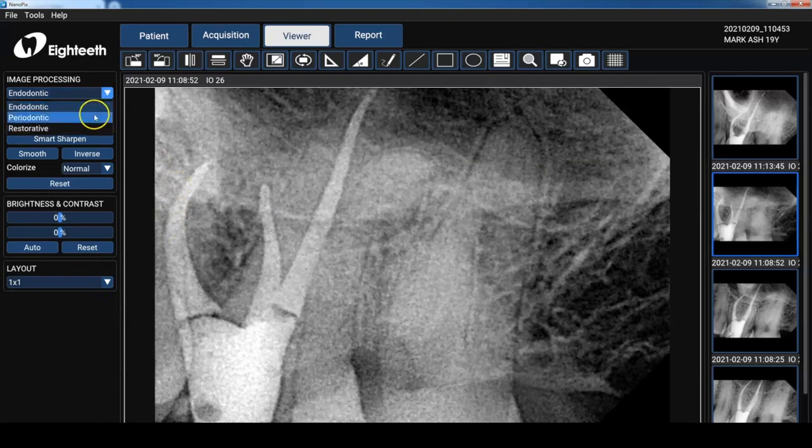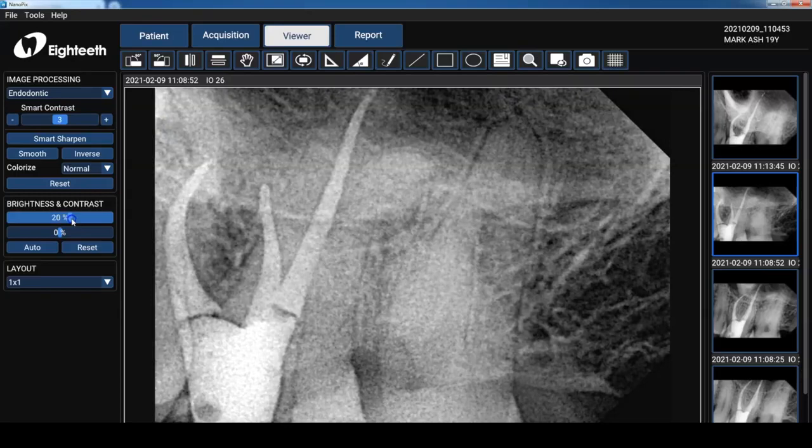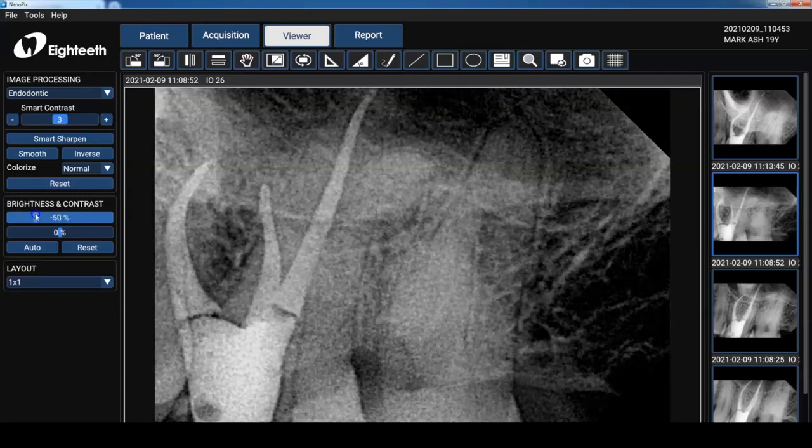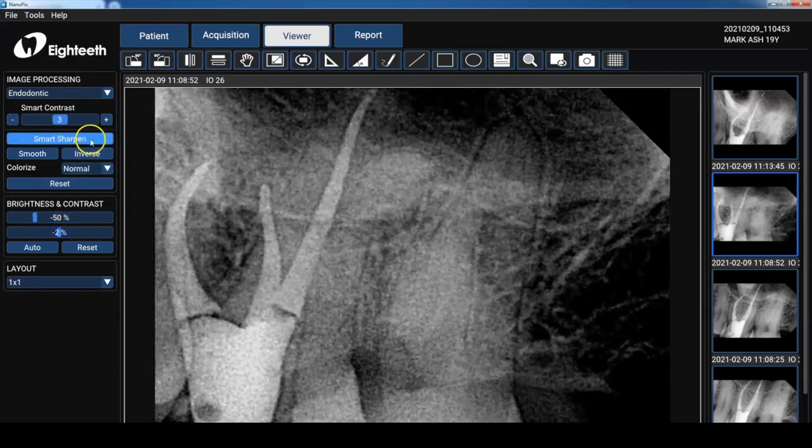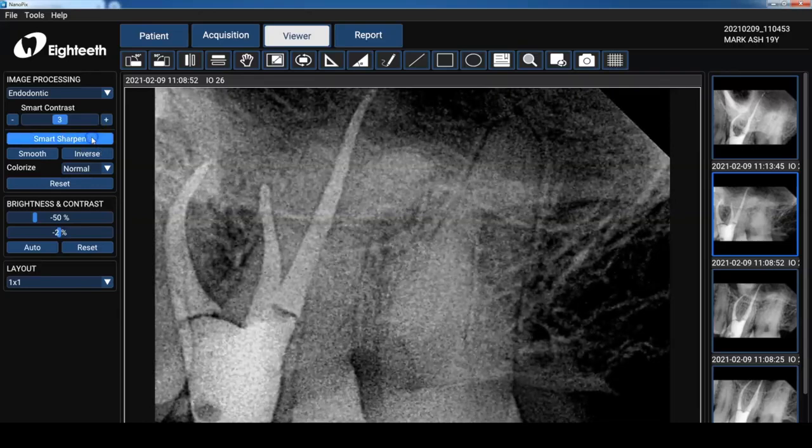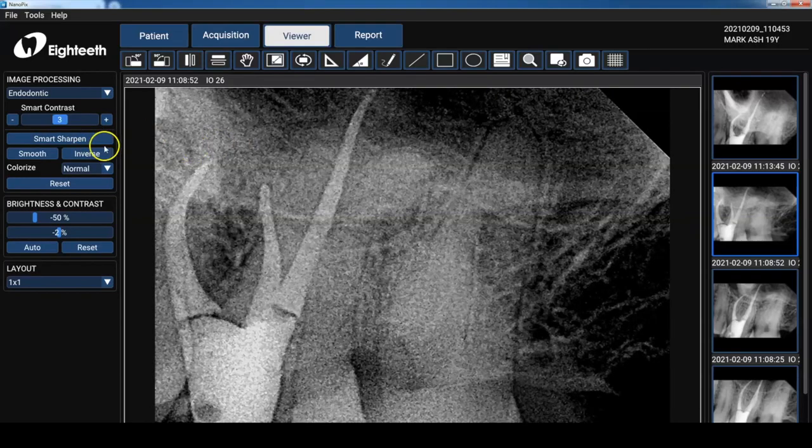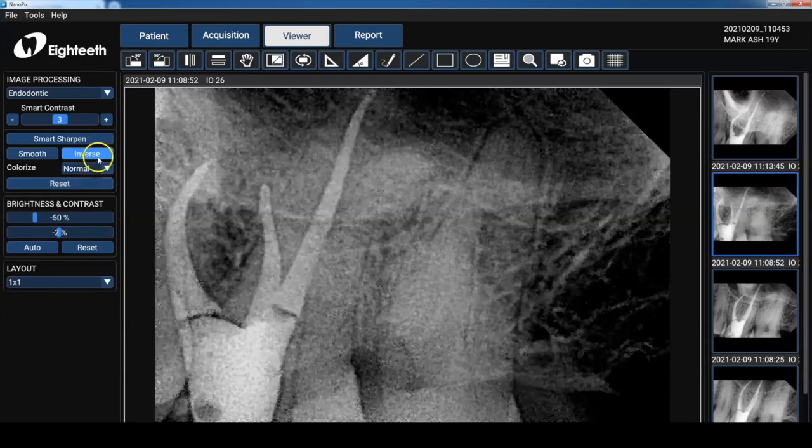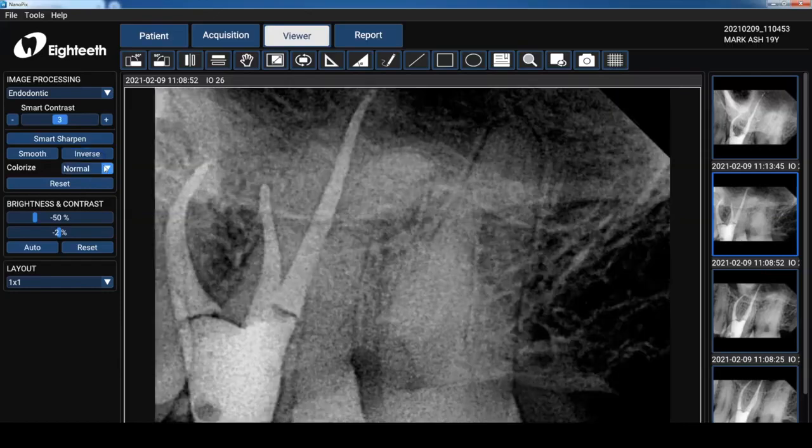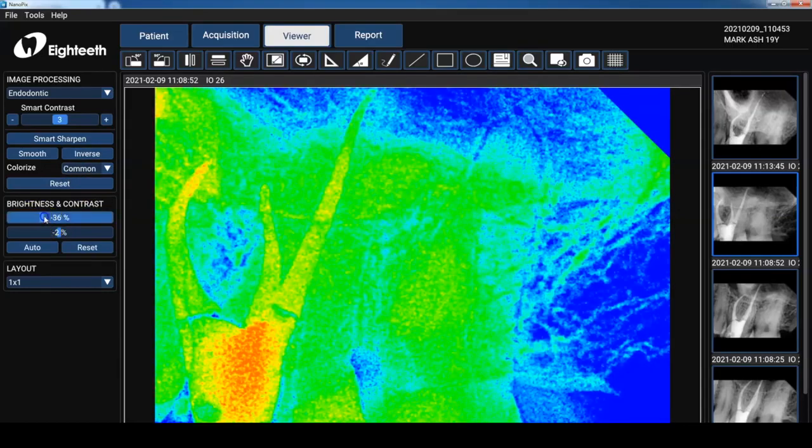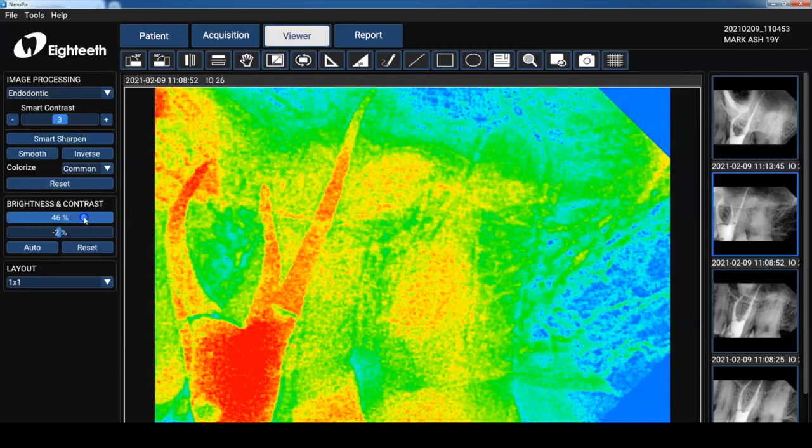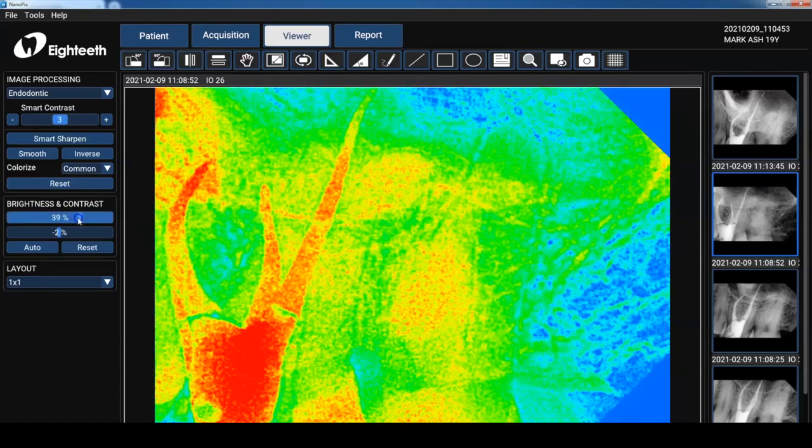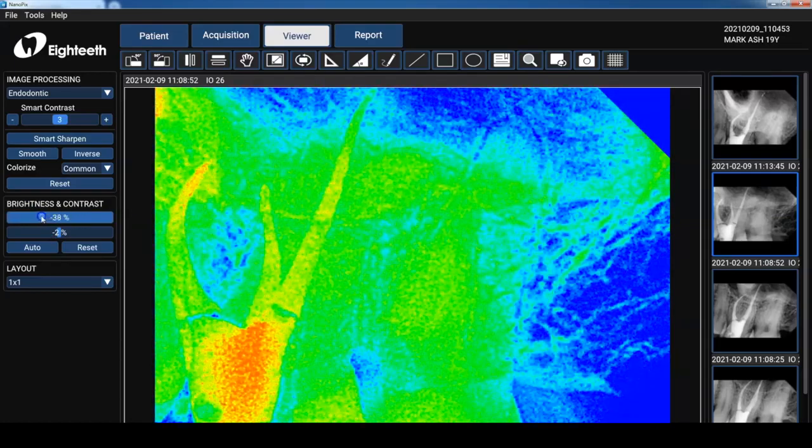Endo but then there's a Perio and we have a restorative filter. I'm going to set that back to Endo. Now I haven't really gotten used to using the smart contrast but I can tell you the smart sharpen I love it. As you press it it increases the sharpness of the image. And for you Facebook posters you can use your inverse as well. So some of the colorized options are available there and of course using the brightness and contrast allows you to manipulate the different densities in the image. So I'm going to set that back to normal.